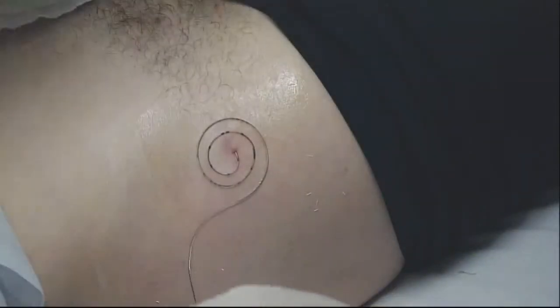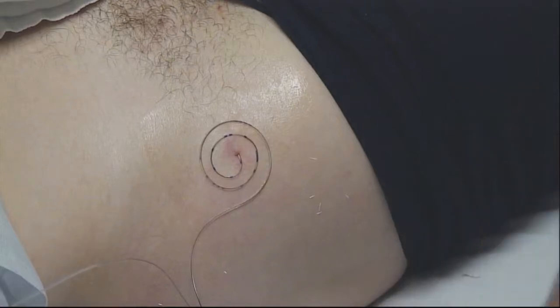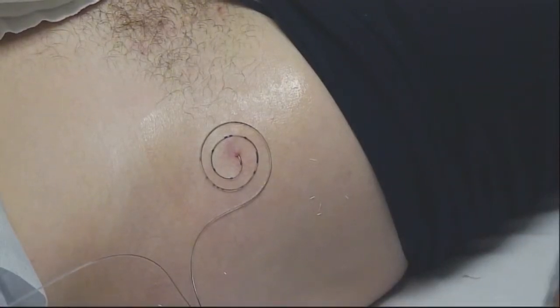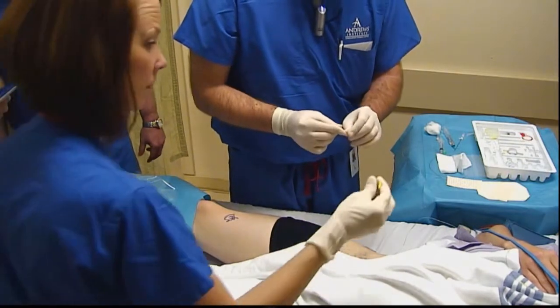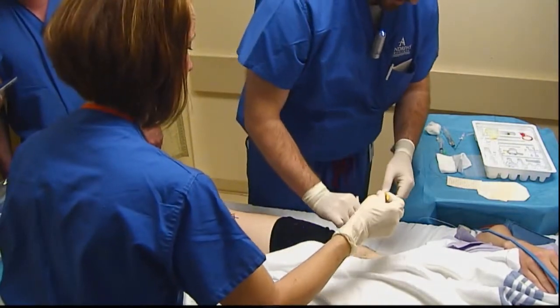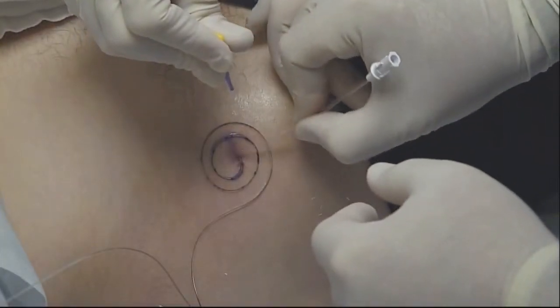Now that we have those loops in place, we're going to apply some Histoacryl. You've seen us do this several times before — this is similar to Dermabond, it's going to be a skin sealant, essentially a surgical glue, and we're going to apply that right over the puncture site.